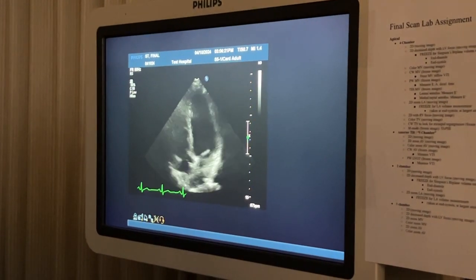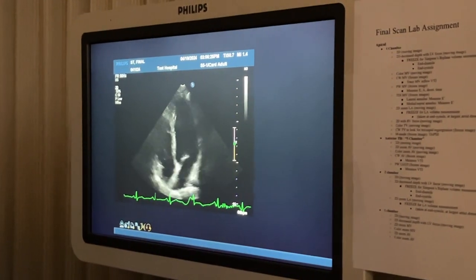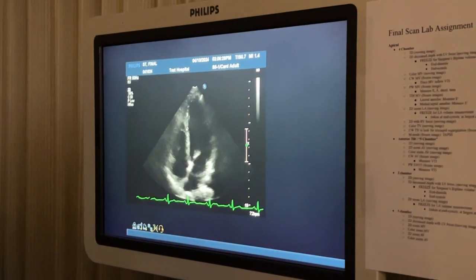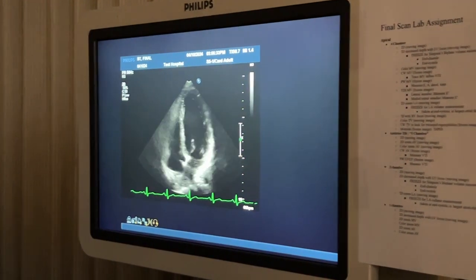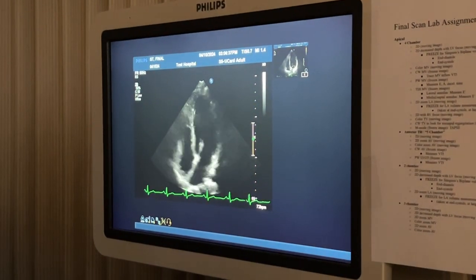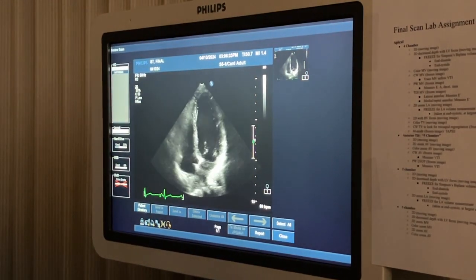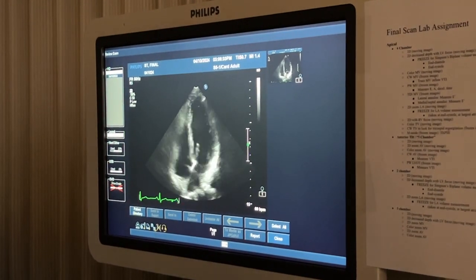All right, so maybe lean forward just a tiny bit more. Yeah, I like that. That's great. See how that brought it in even better? That lean forward. Yeah. How nice is that? All right, so first of all, I'm just gonna take a 2D moving image. That's our first picture. Is it prospective or retrospective? I'm just gonna check to see if this is seeming prospective, or retrospective, which is what we've had the whole time. Just wanted to double check.